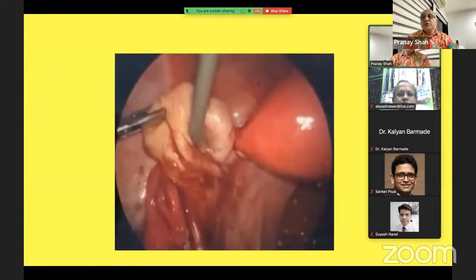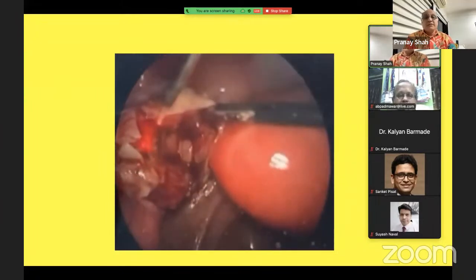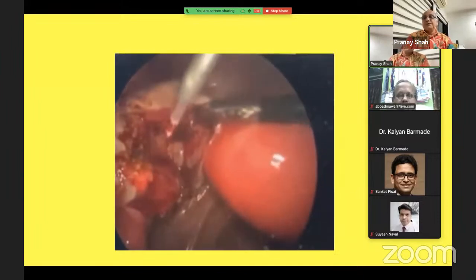A video showing the use of carbon dioxide laser to treat ovarian endometriomas. The cyst is drained, lavage given. You can notice the precise coagulation and the minimal depth of penetration while carbon dioxide laser is being used.